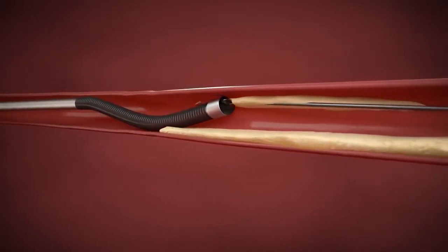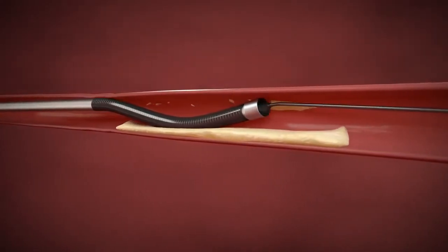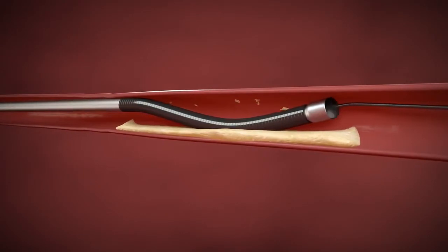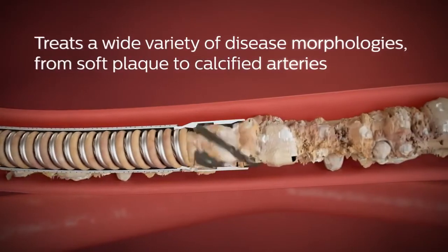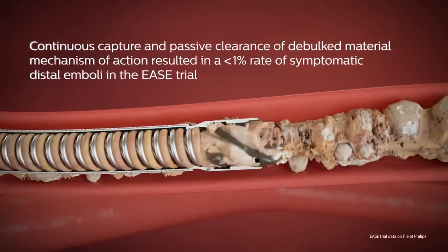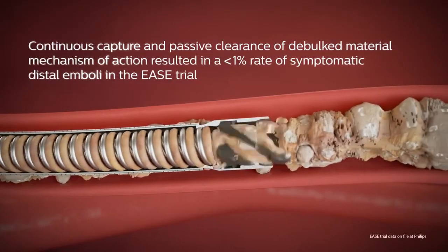The 2.4 millimeter Phoenix combines all of the key design features of the smaller diameter variety, addressing a range of disease morphologies from soft plaque to calcified arteries. Its continuous capture and passive clearance of debulked material ensures effective treatment.